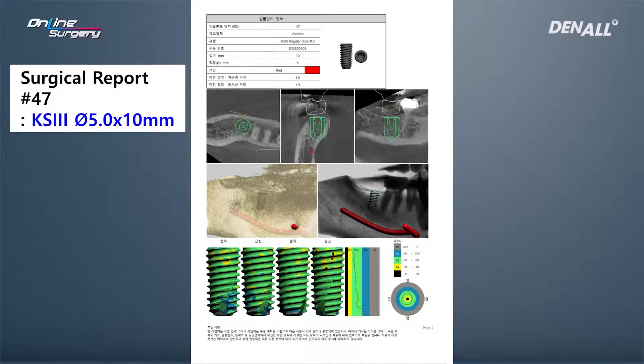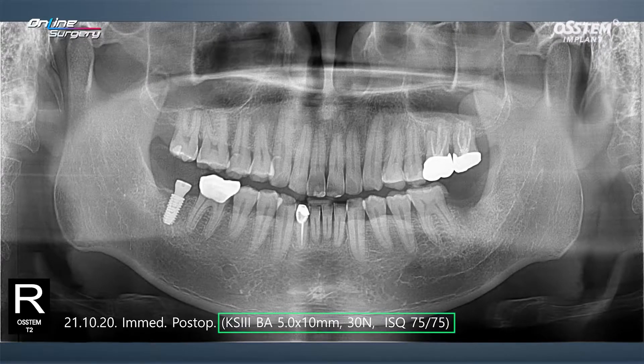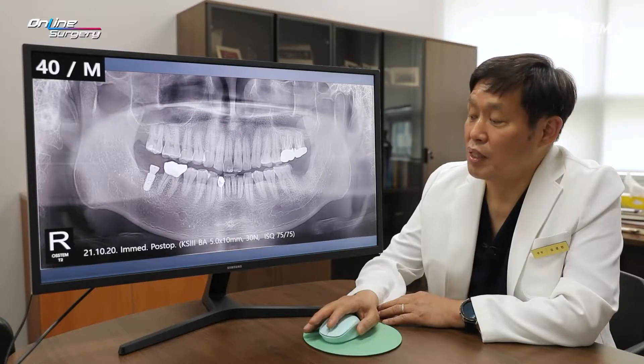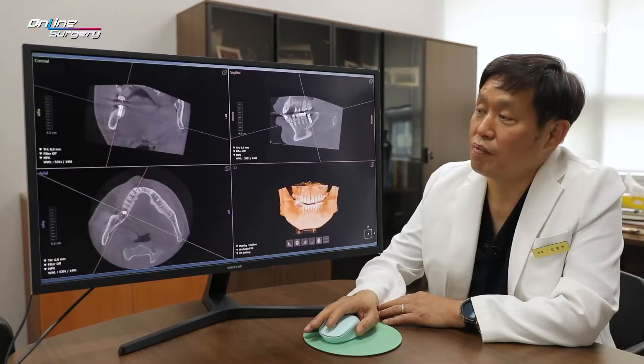A KS3 BA surface, diameter 5.0 by 10 mm implant was planned and placed. There's not going to be a major issue. At the time of implant placement, primary stability was sufficient — over 30 N·cm — and the ISQ was 75, so quite favorable.